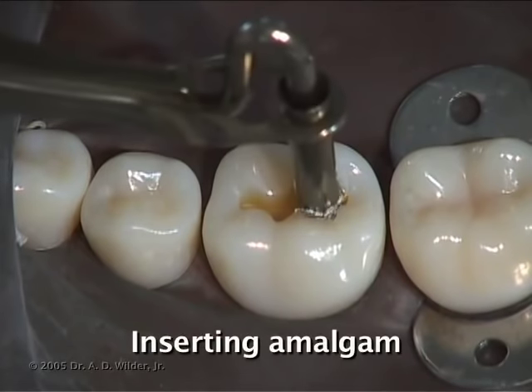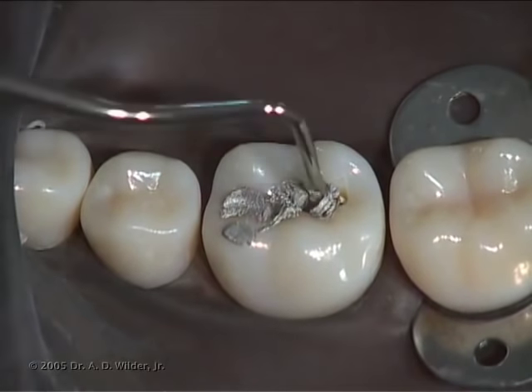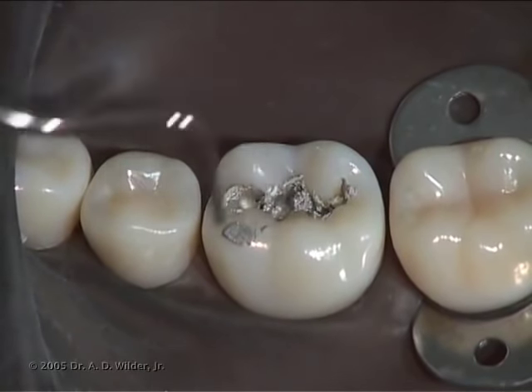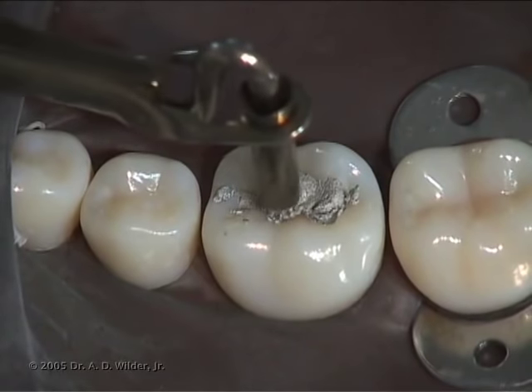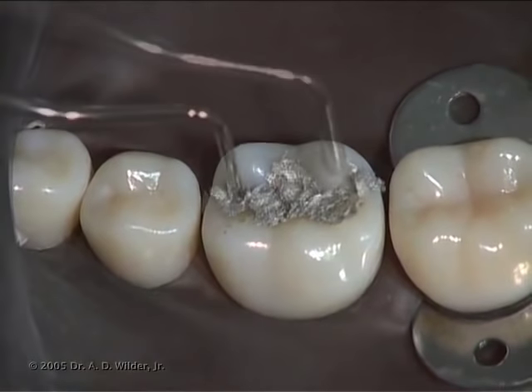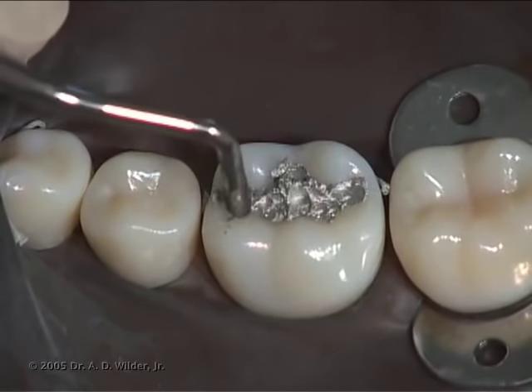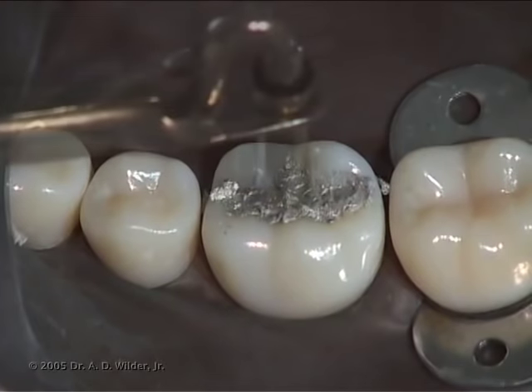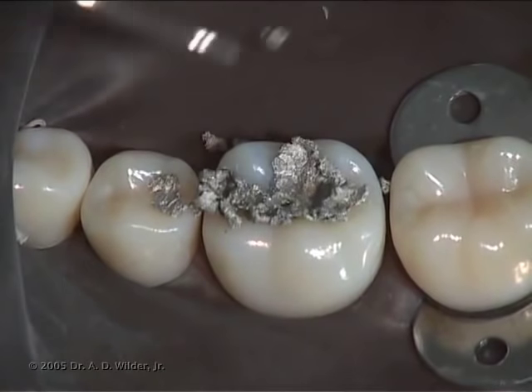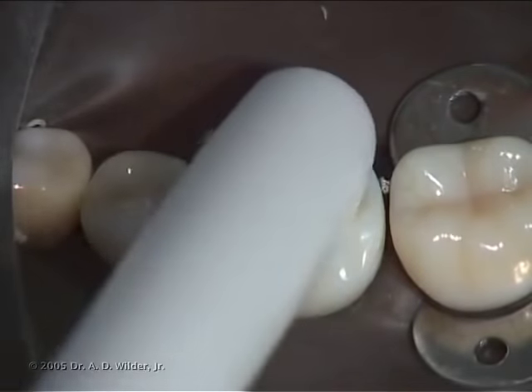After loading a triturated mix of amalgam into the amalgam carrier, insert it into the base of your preparation. With the small end of the condenser first, compact the pliable mass of amalgam against the internal line angles of your preparation. Place new amalgam as needed, and condense firmly and thoroughly to ensure that no voids are present. You can overfill the preparation with another batch of amalgam to ensure that there will be no shortage of amalgam and consequent ledge between amalgam and natural tooth after condensation is completed. Use a high volume suction device to remove any excess.